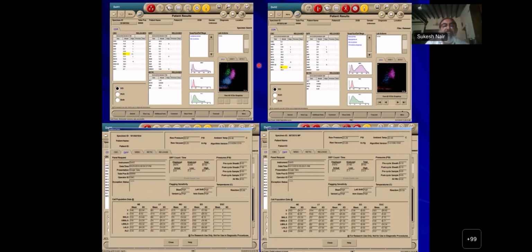Here you can see a case of vivax. You can see that many non-lysed red cells have been counted as lymphocytes. They are under the lymphocytes, while here you can see that they are closer to the y-axis. That's falciparum. This one is vivax.